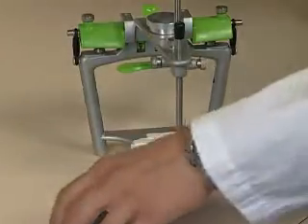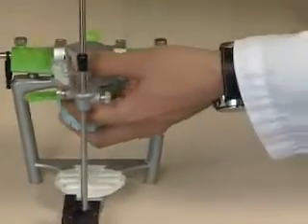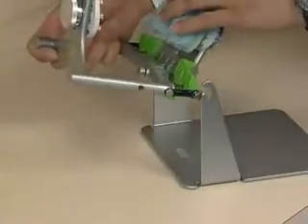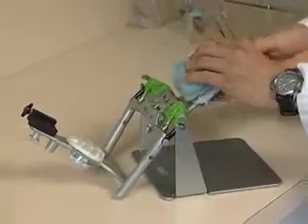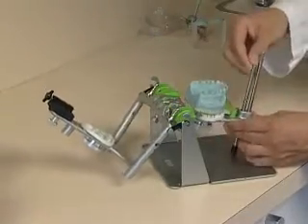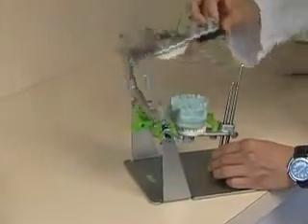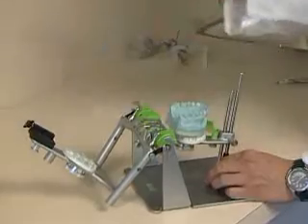Now we're going to get ready to mount the lower model. We'll put the upper model back on, then put the articulator into the mounting stand so the top of the articulator fits over the plate of the mounting stand. Now we'll determine the final length of the anterior pin when we put our wax bites on and our lower model, because we want the base of the lower model to be parallel to the floor.